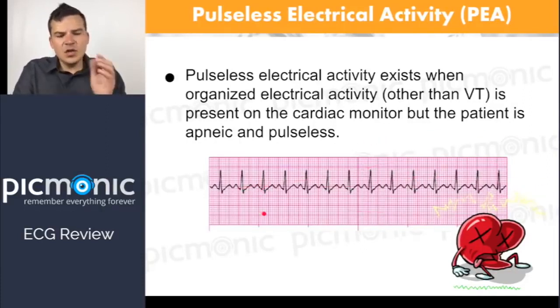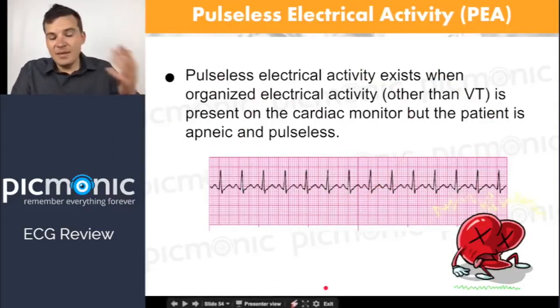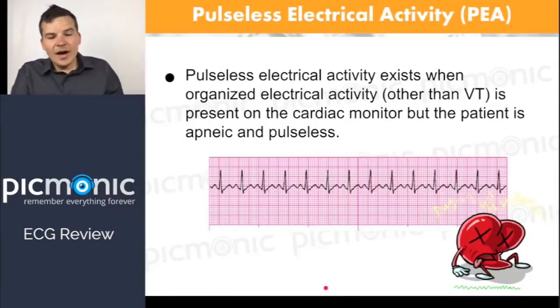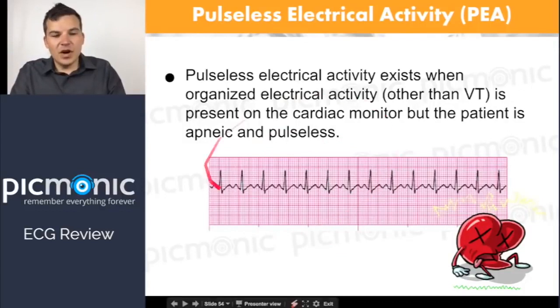But the thing of it is you may have electrical activity on the cardiac monitor, but the patient may actually not have a pulse. That's where you always need to make sure you have that rule: check your patient, treat your patient, not the monitor, because this one could get you in trouble. I don't see beautiful PEA that often, maybe more than once in my entire life. That was at a rate of like 50 that I thought was sustainable for life. But that was just because there were so many drugs given that I felt the electrical activity had to at least be going on. But unfortunately, the heart muscle just wasn't responding.